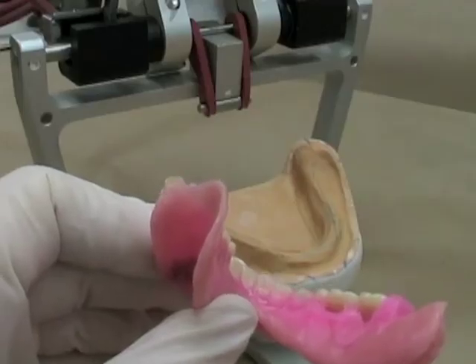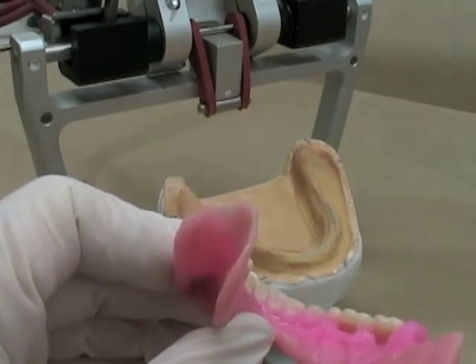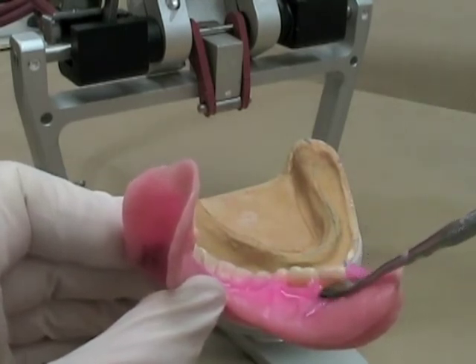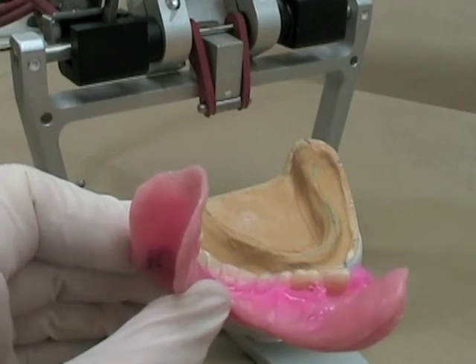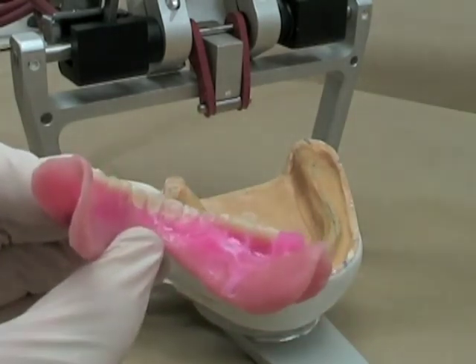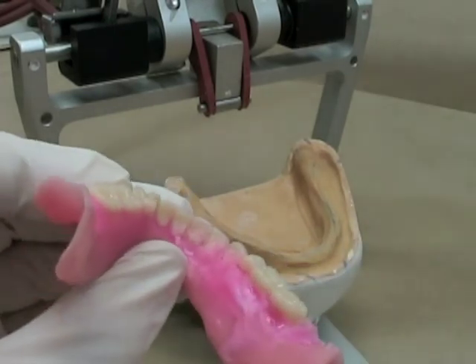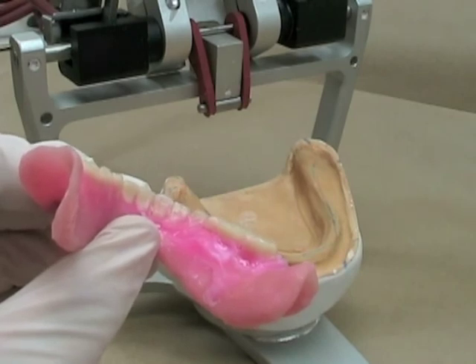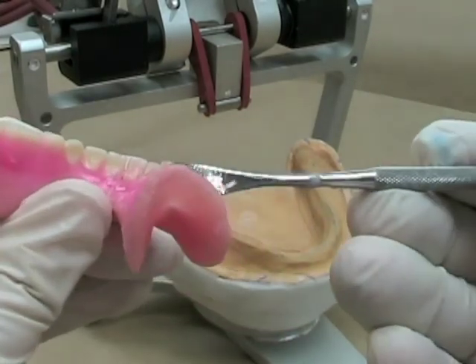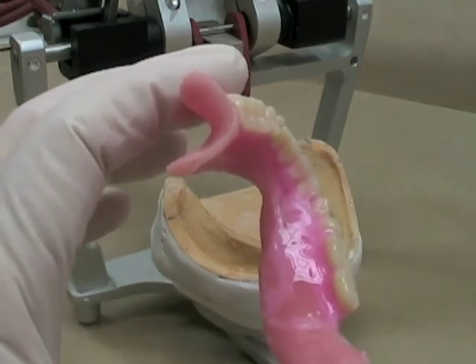On the lingual surface you can see that we've got some gaps there — we're just going to fill those in with some molten wax. We'll also remove some of the excess wax at the very back which we don't need. As you get that filled in, you can just use your torch once in a while to smooth over the wax.